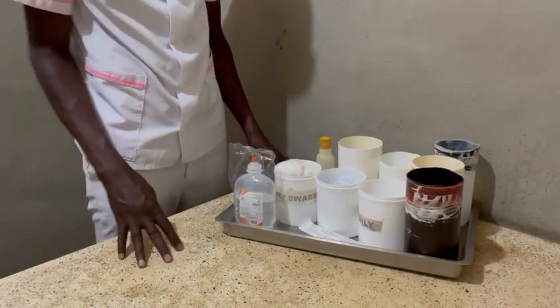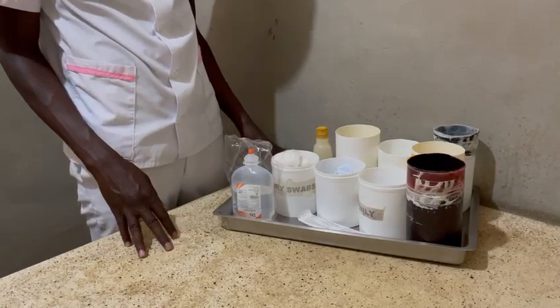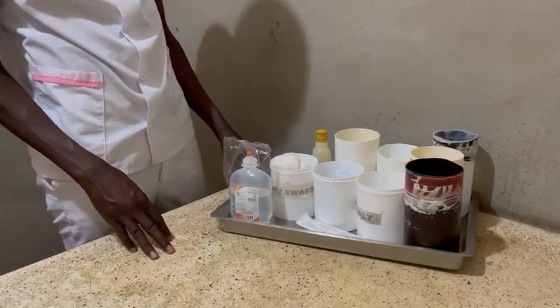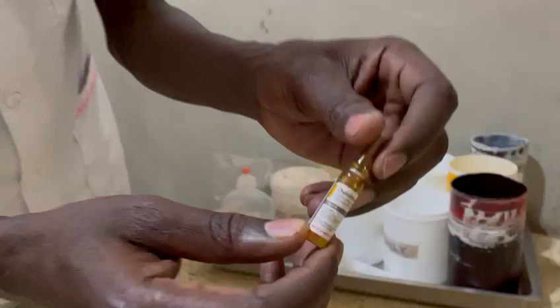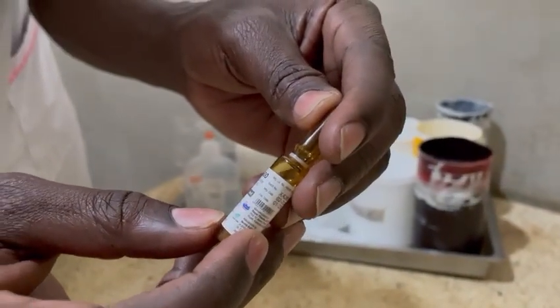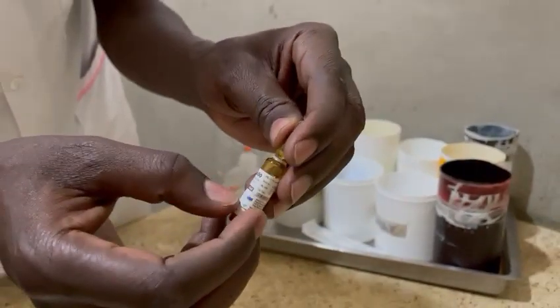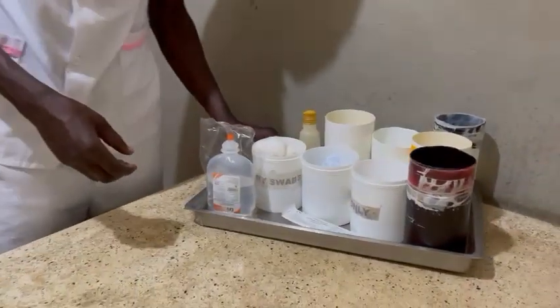Welcome back guys. Today I'm going to show you how I dilute IV quinine when it is prescribed to a child. We are going to use this drug — quinine — one vial, one ampoule is 600 milligrams in two mils, as you can see.